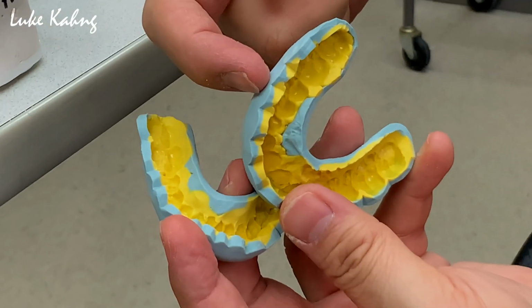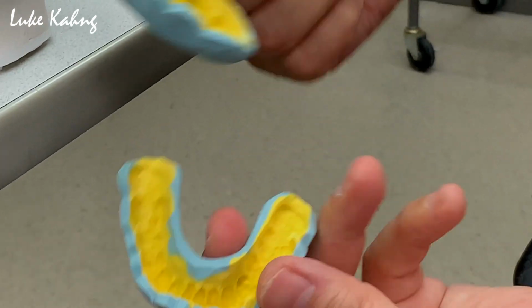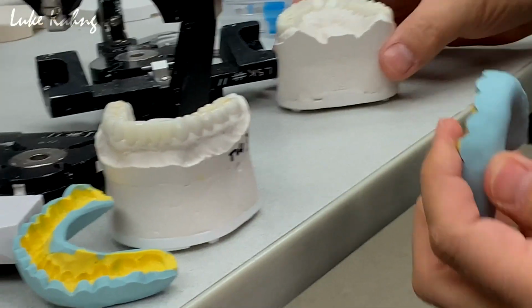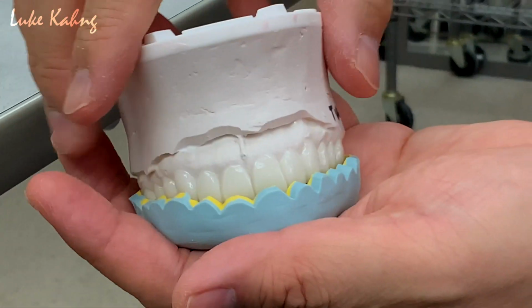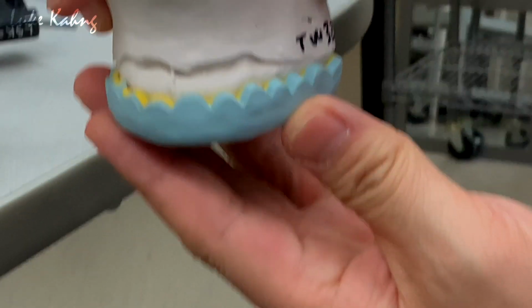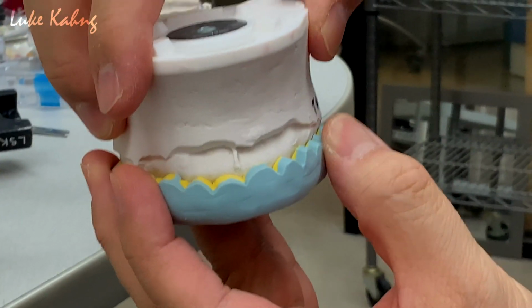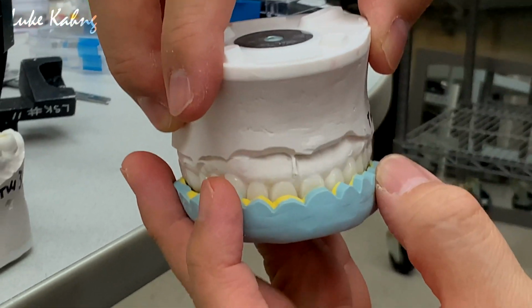Here's a regular putty from GC America, and this one is light body and heavy body, and give it to the doctors. Not only this, we just cut that margin area, and then the doctor can use this easily like this in the mouth.